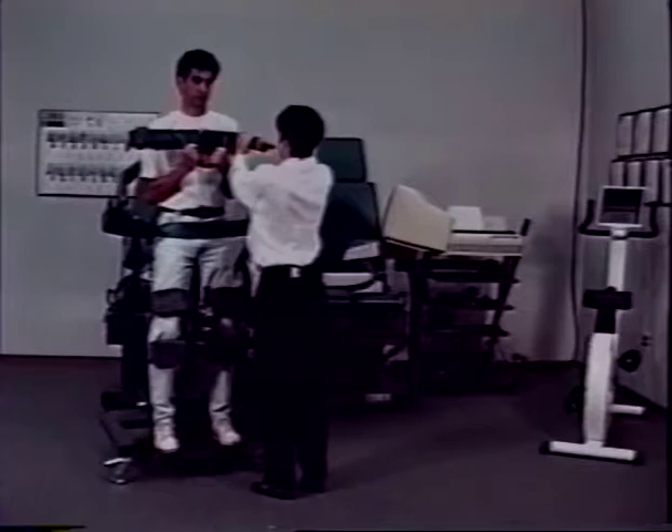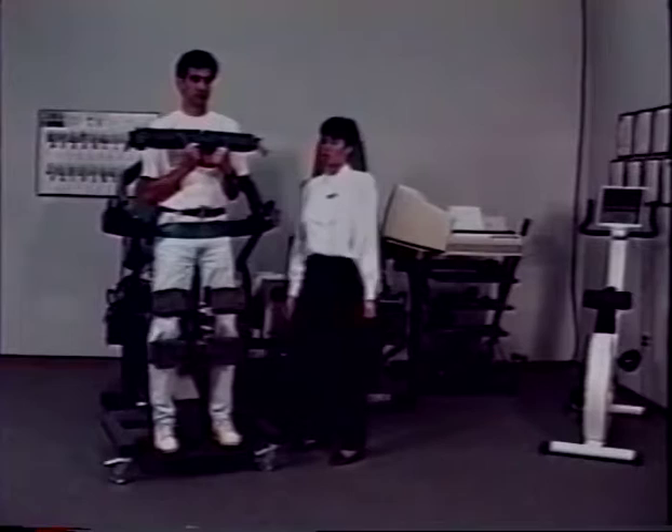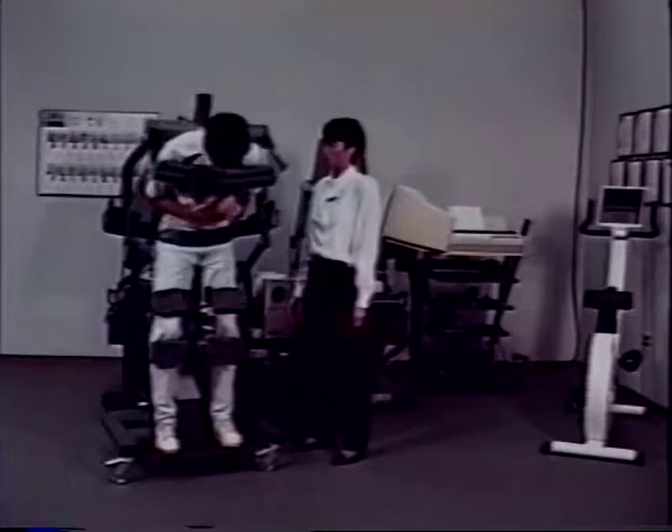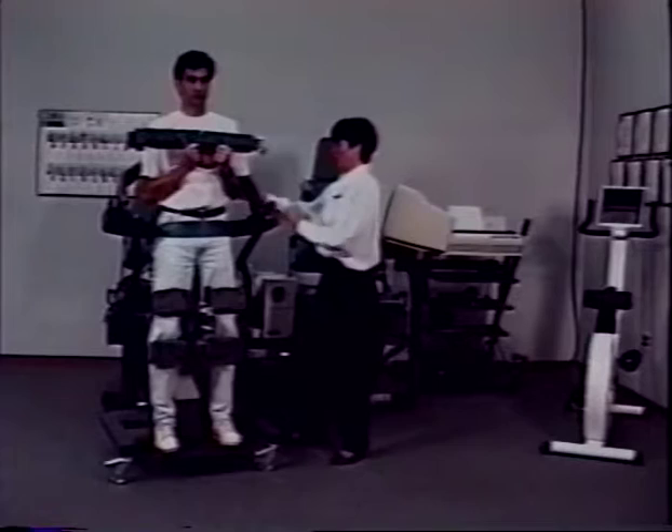To ensure that your axis of rotation is accurate, have the patient perform several repetitions. If the axis is incorrect, there will be movement of the patient along the seat pad. In order to set your anatomical zero, you will have the patient in the full upright position.